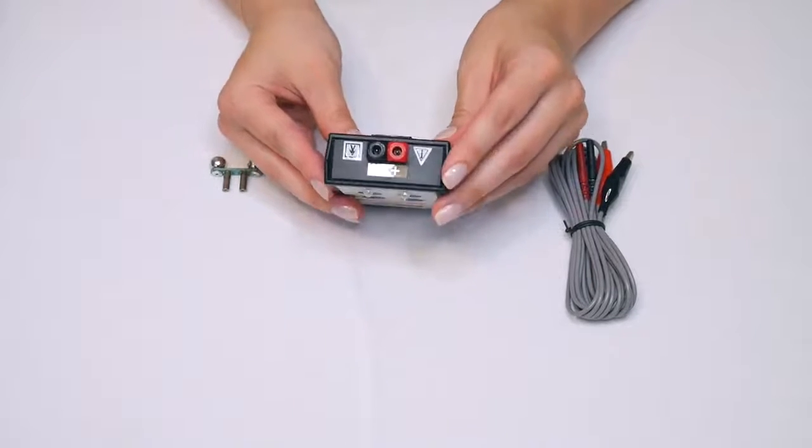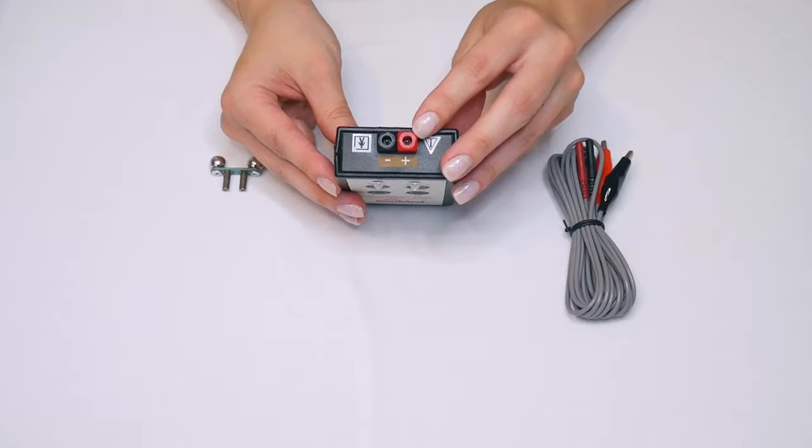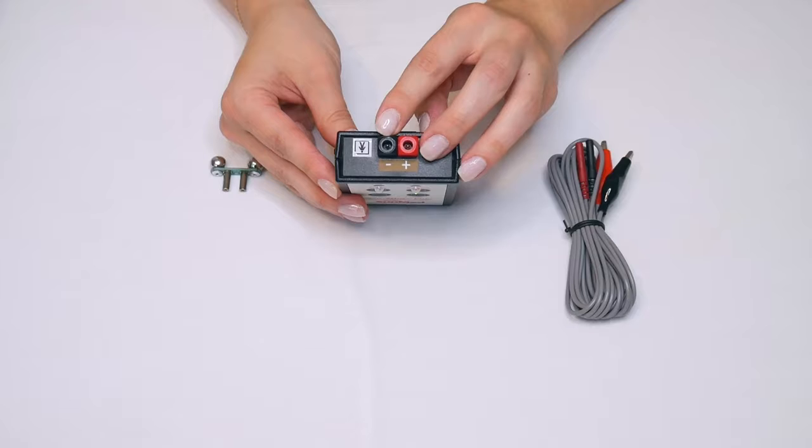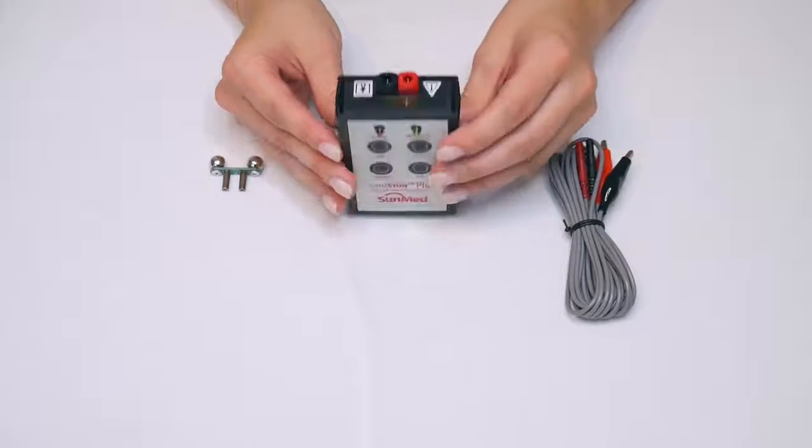At the top of the Nerve Stimulator, you have your connectors. Red is positive — this will be your proximal lead. Black is negative, and this will be your distal lead.